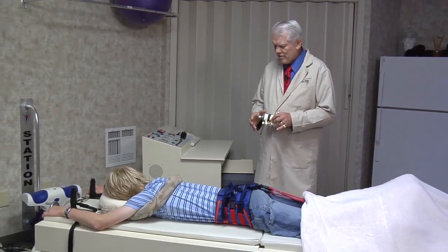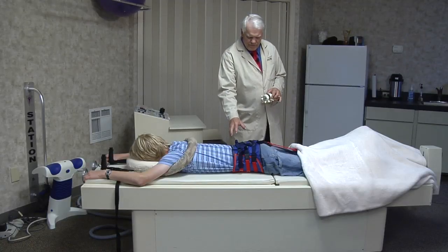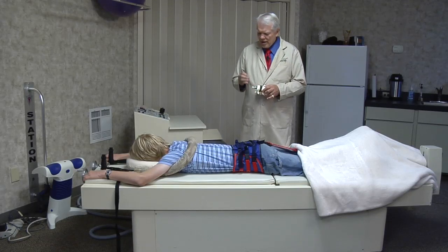The VAX-D basically measures how the muscles are responding to the treatment. It measures the spasm from one side or the other, how much tension is in the muscle, and how rigid the spine is getting.